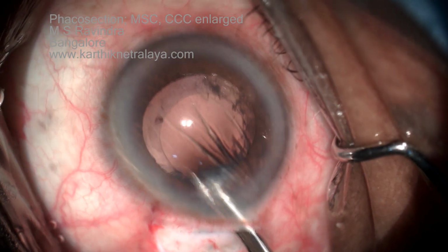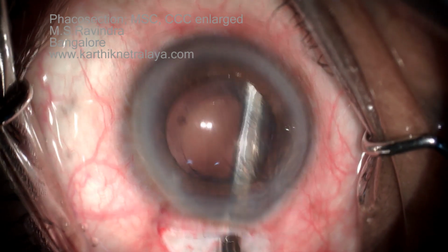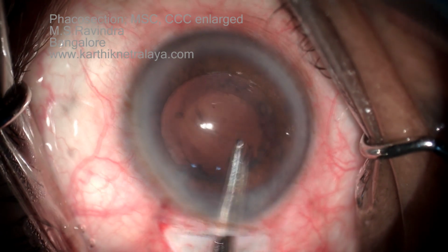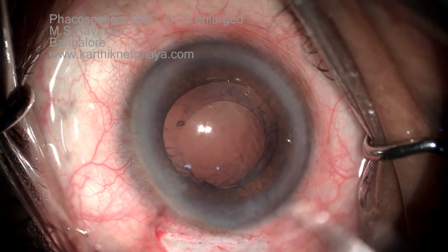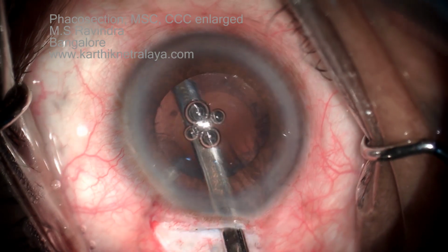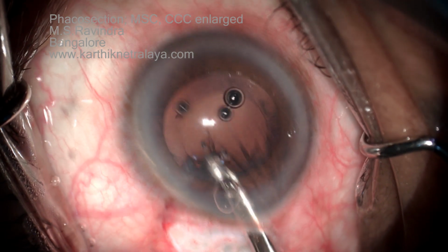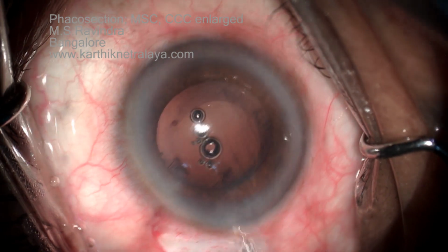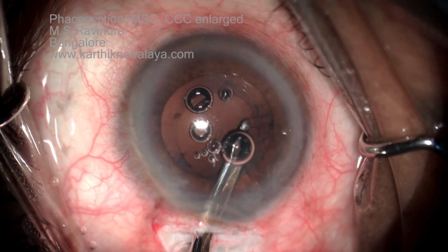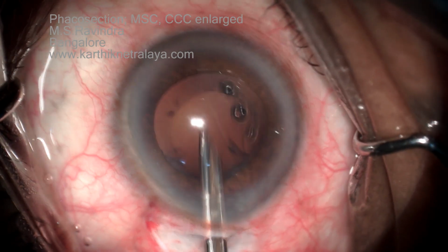A 12 o'clock cannula is used for the right side and left side cortical aspiration under the tunnel. The cortex will be in bits and pieces. It's not like strands in an immature cataract. So you need to go to every clock hour, specifically looking for chunks of cortex.